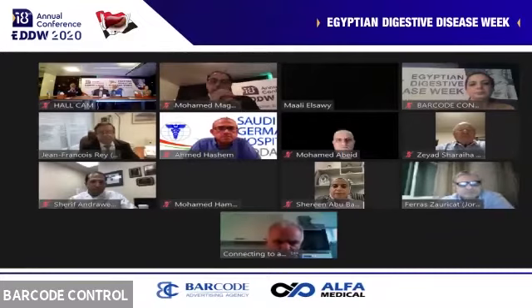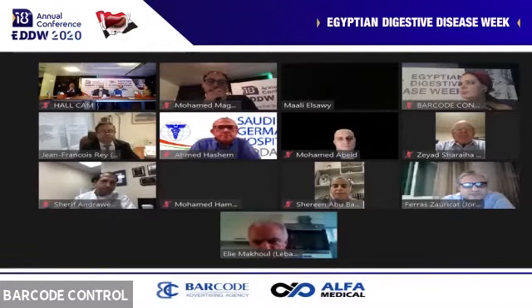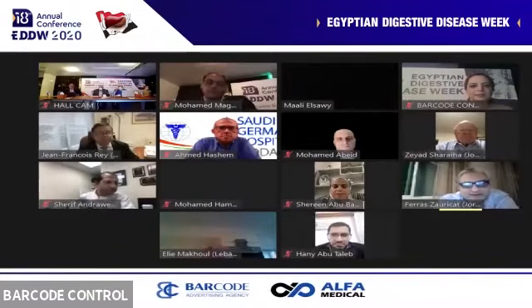Any other question from the panelists for Dr. Maali before we have our next presentation? Dr. Maali, thank you for the presentation. It was lovely and refreshing. What do you think is the average time we should spend inspecting the stomach?